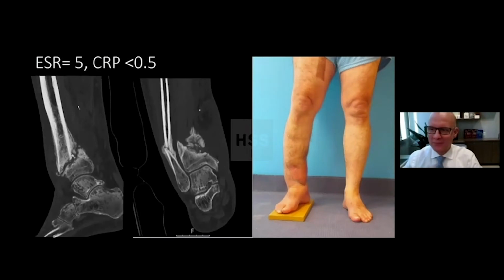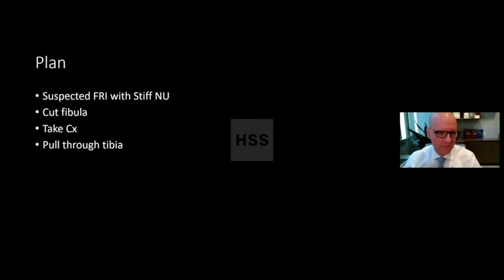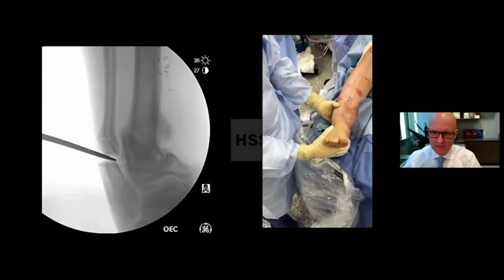So how to treat this? I treated it with an external fixator, tried to utilize the inherent biology, and there were no clinical signs of infection, negative labs and everything. So we figured this was a burned out infection after all the hardware had been removed, and treated this with fibular osteotomy and then gradually pulling through the non-union. Fibular osteotomy.